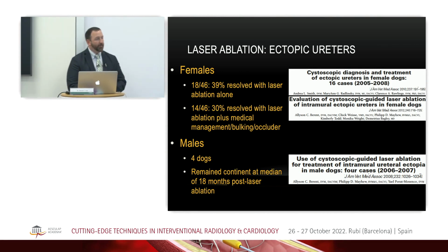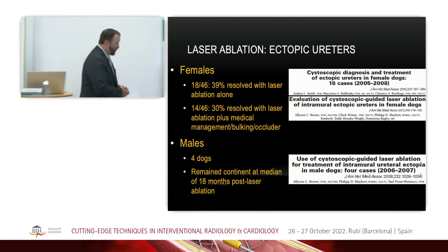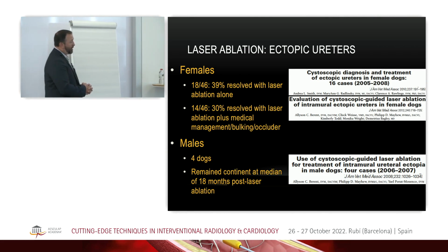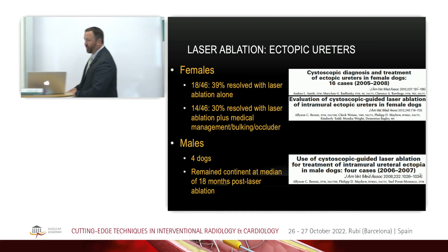One nice thing about this, though, is that the laser ablation is actually a great technique, and it makes us, I guess, feel a little bit better about moving forward with the treatment because it is such a minimally invasive option. I do think that they have the potential to do better with this than the historical surgical options.